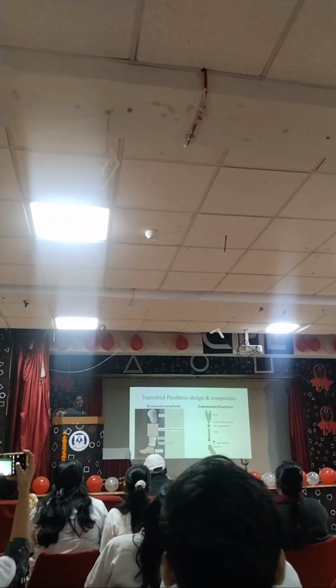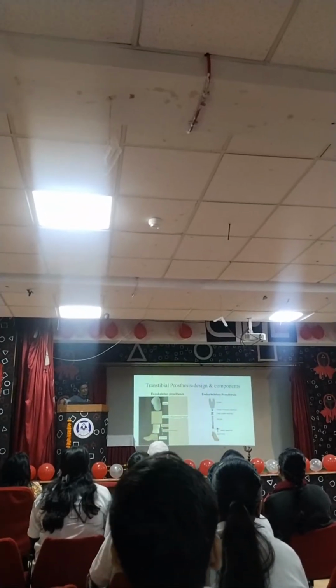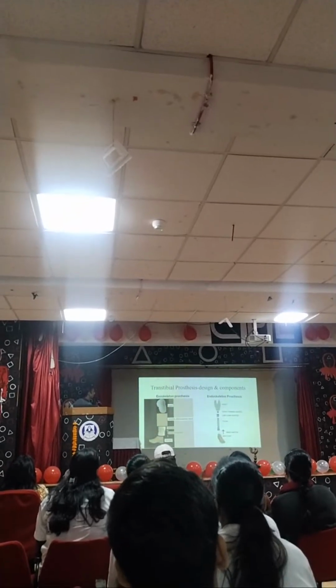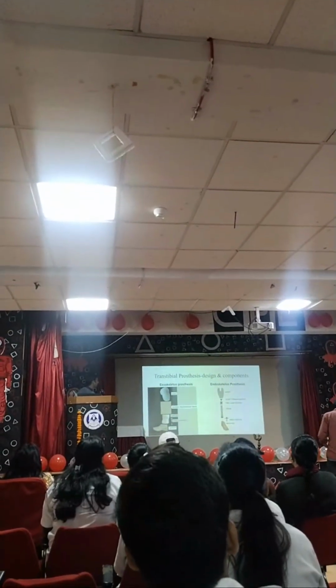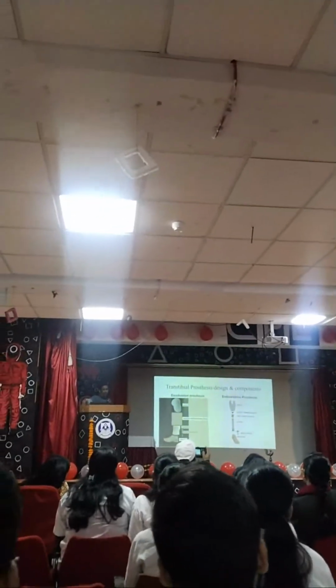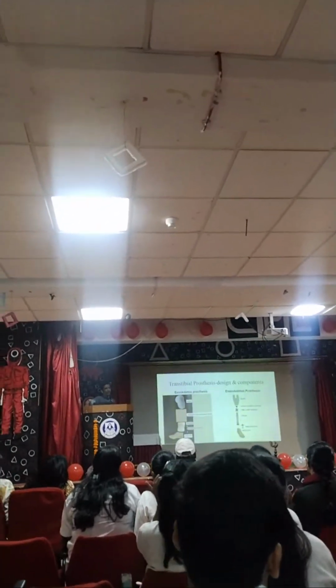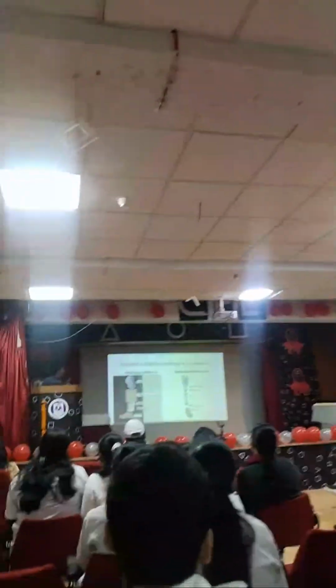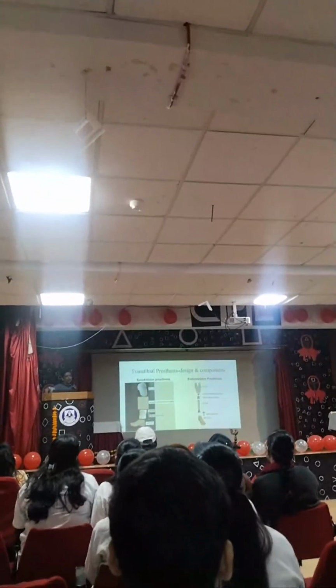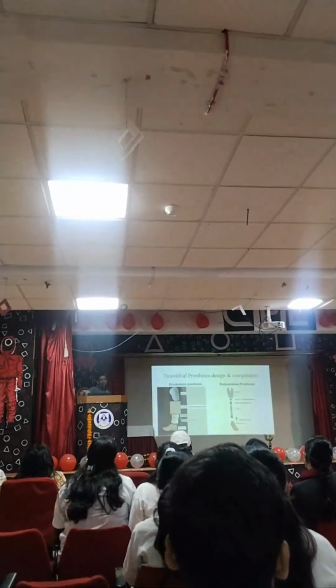So here the picture is showing what could be the components of exoskeleton or endoskeleton. We can see the socket, wooden shin or extension block, ankle block, bolt, nut, ankle, SACH foot. Foot is just one type of foot I mentioned here, the SACH foot, but there could be different other feet also. So these are the exoskeleton components, and there could be endoskeleton, which is also known as modular components.